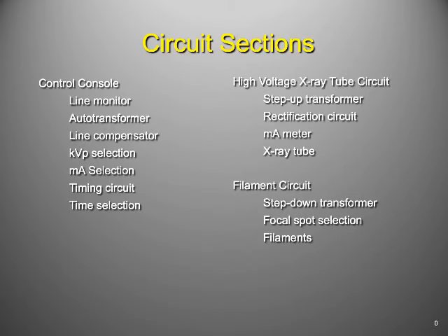So here again in review is the way that I think about the circuitry of the X-ray tube. I think probably the best thing that you could do with this slide is just in your notes or using your textbook, make flashcards for each and every one of these points. For control console, line monitor, auto transformer, and just detail what they are. You can draw pictures of them, whatever you want. But each one of these things we need to be able to define.